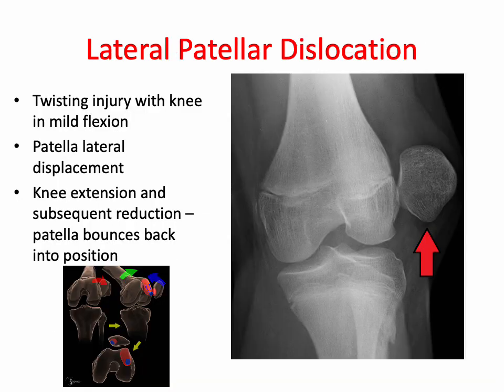Patellar dislocation accounts for about 3% of knee injuries and most commonly results from a twisting motion, particularly with the knee in flexion and the femur rotating internally on a fixed foot. There are risk factors for recurrent dislocations, which include trochlear dysplasia and patella alta. Dislocation commonly occurs as a result of disruption to the medial patellar retinaculum. Plain films demonstrate a lateral displacement of the patella on frontal or skyline projection, and can also be associated with a joint effusion.